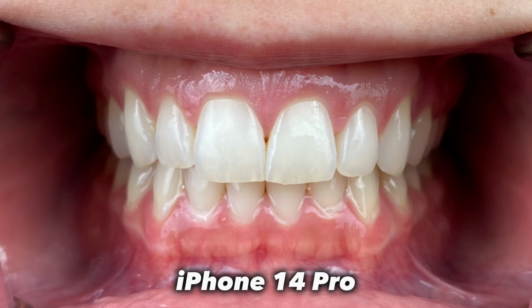So can I get away with taking dental photos with this camera? Yeah, if you're showing it to your colleagues, associates, whatever. But as far as posting on social media and Facebook, and you're trying to compete with the big dogs out there, I would definitely recommend that you still get a mirrorless camera. Like I said, this camera is still pretty nice, but I don't think that it's up to par with a mirrorless camera from Sony.